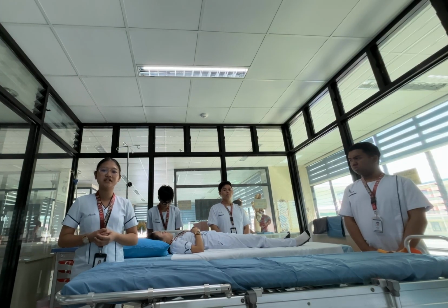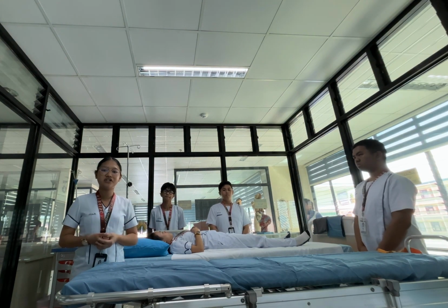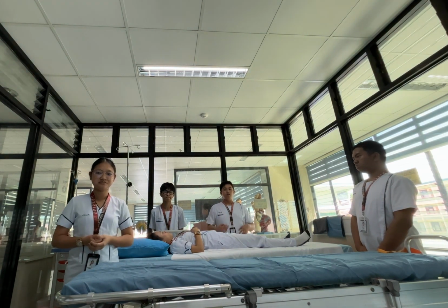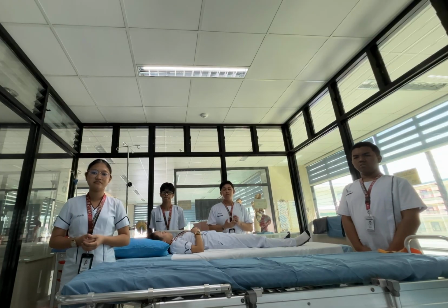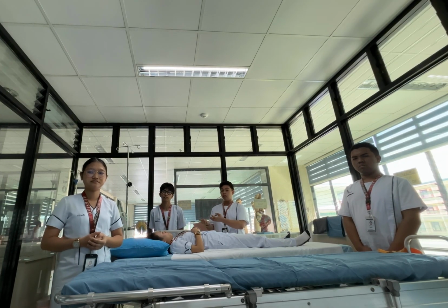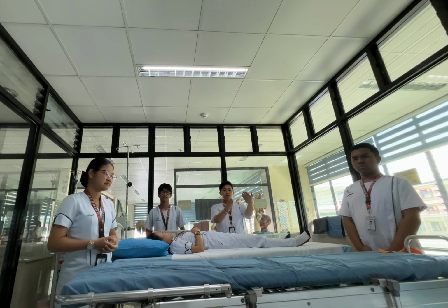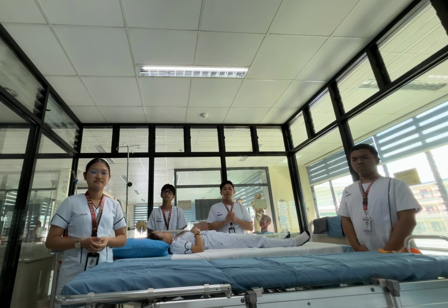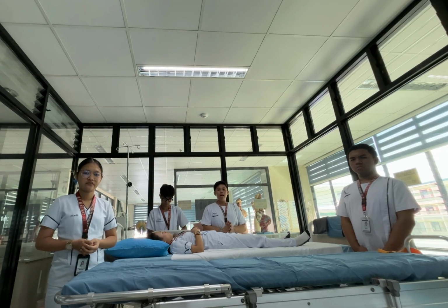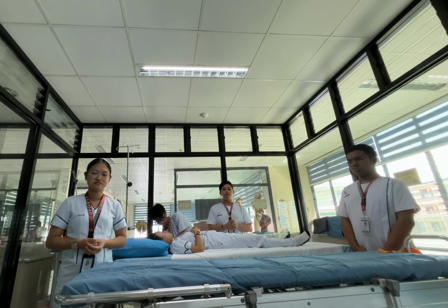First, always predetermine the number of staff required to safely transfer a patient horizontally. Next, place the head of the bed in a flat position or as low as the patient can tolerate. Then raise the bed to the same height as the transfer stretcher and lower the side rails. Keep the patient comfortable by putting a bath blanket over the patient and removing the top covers underneath.